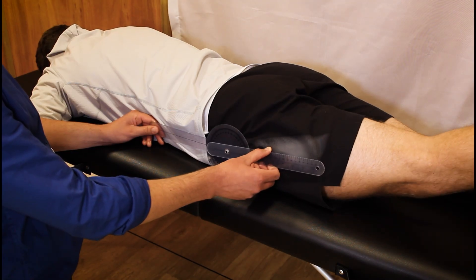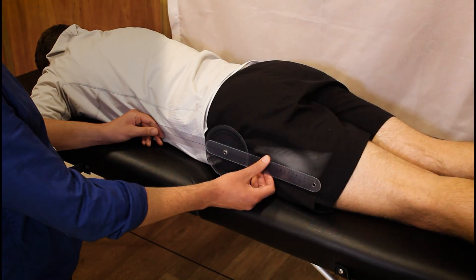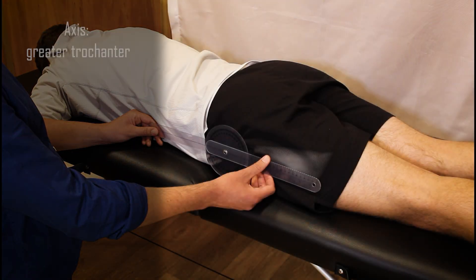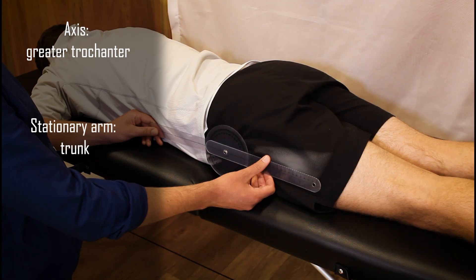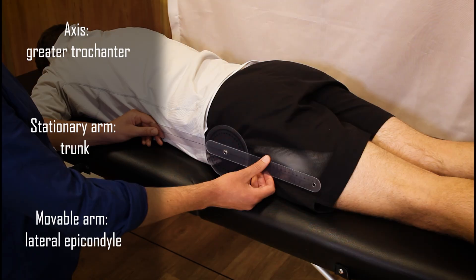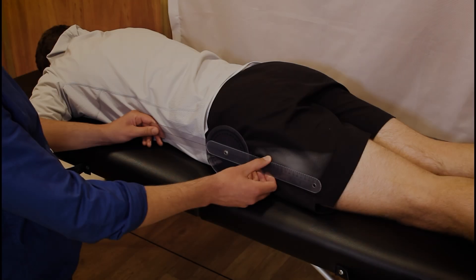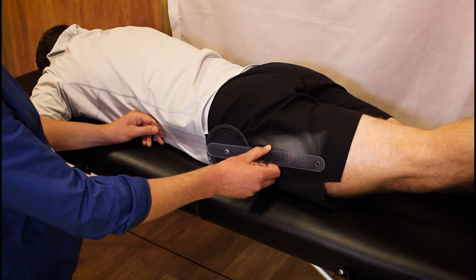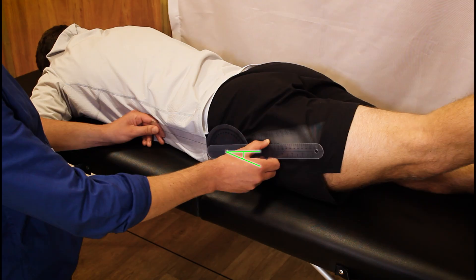To measure hip extension, the patient is positioned in prone. The axis of the goniometer is placed over the greater trochanter of the femur, with the stationary arm parallel to the trunk and the movable arm parallel to the femur pointing to the lateral epicondyle. Ask the patient to lift their leg up as far as possible and ensure they avoid lumbar extension.